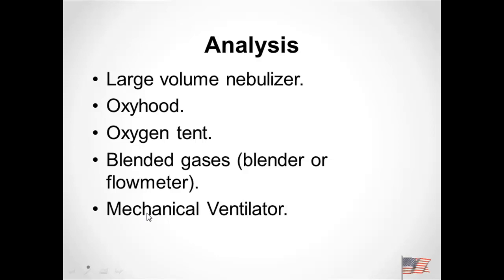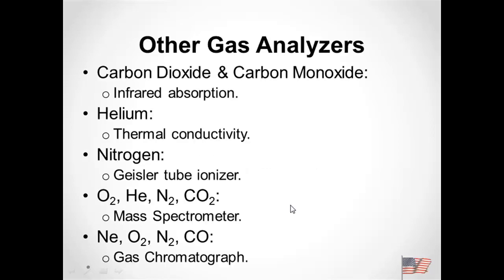Most mechanical ventilators manufactured today have built-in analyzers. So we don't even have to calibrate anything. It does it automatically. Now, oxygen's not the only gas that we analyze, as we'll find.